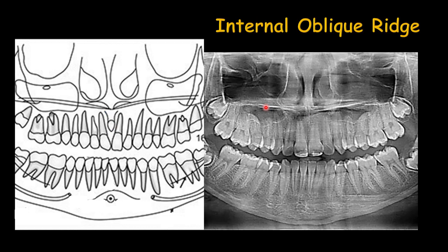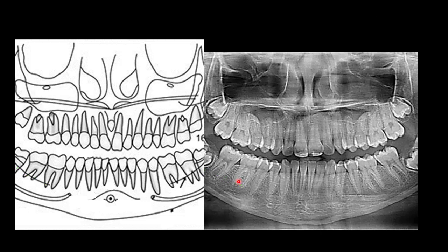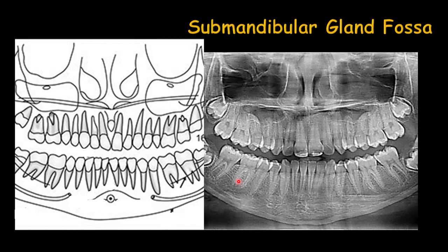The internal oblique ridge, sometimes called the mylohyoid ridge, is a single opaque line underneath the mandibular molars located on the lingual side of the mandible, where the mylohyoid muscles attach. Beneath the mylohyoid ridge we have the submandibular gland fossa, which appears as a radiolucent shadow because of the depression of the bone in that area for the gland — it is thinner bone, so it appears radiolucent in the panoramic radiograph.